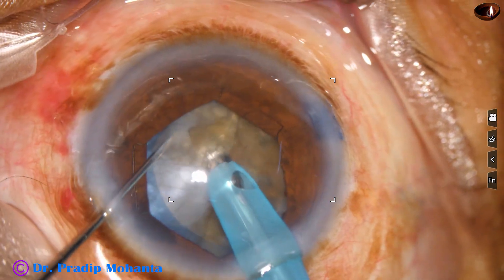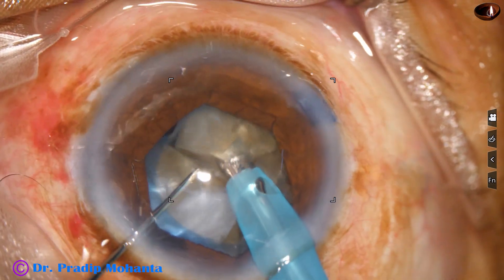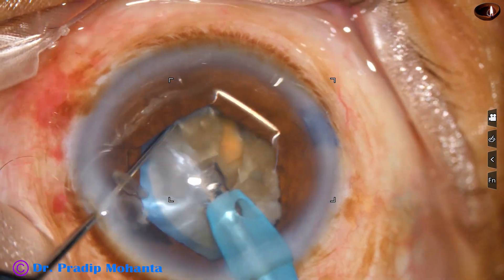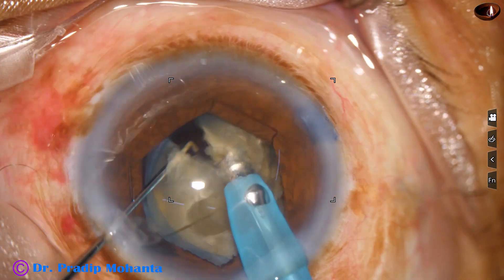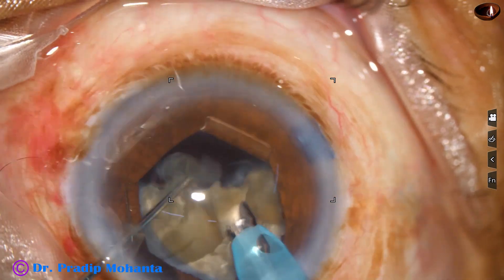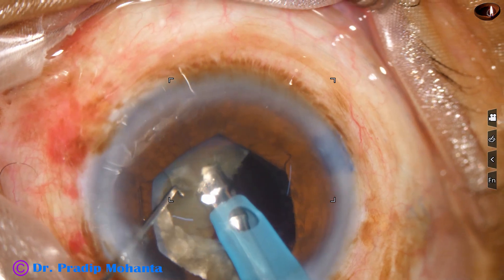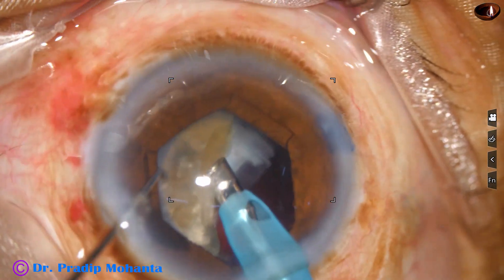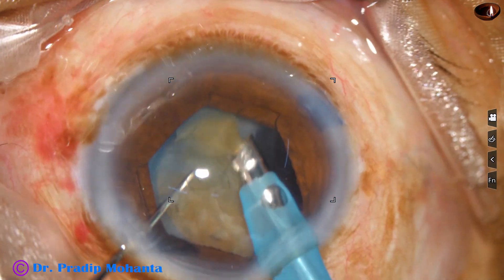Again I go through the substance of the nucleus and make another chop. As a submarine goes through water, here the phaco needle goes through the substance of the nucleus and in this process of movement it cracks the hard nucleus — it already makes a crack in its path. We can use any chopper to divide the nucleus into pieces. This chopper is a modified Sinski hook designed by me; it is known as Mohanta's chopper.